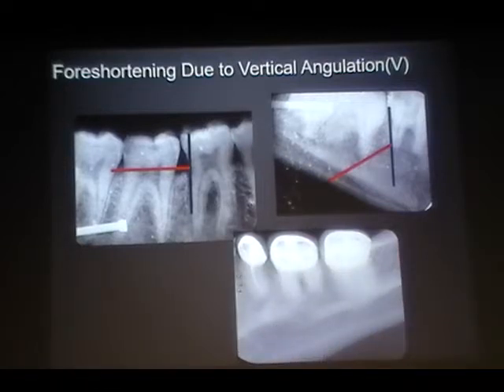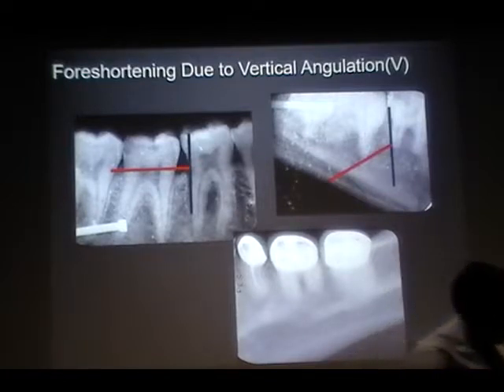So I have a quick question. Yes. If you're doing endo, can't you use, since you've already done endodontic treatment in that tooth in the front, couldn't you use that if it's already in your notes, that you have that length, and use the measuring stick to do a comparison? Not everybody will be smart like you, Jacob. Yes, you could. Okay.